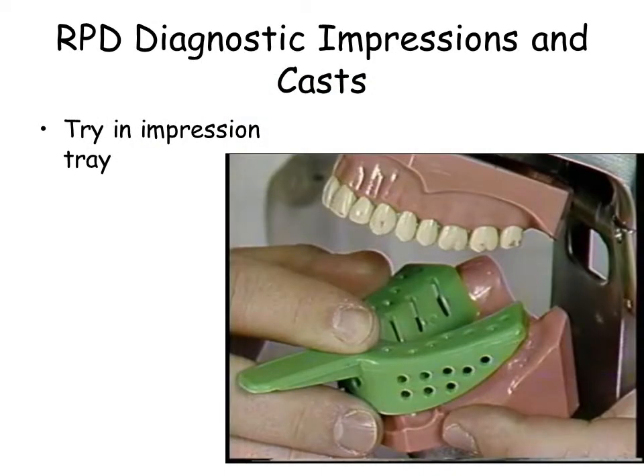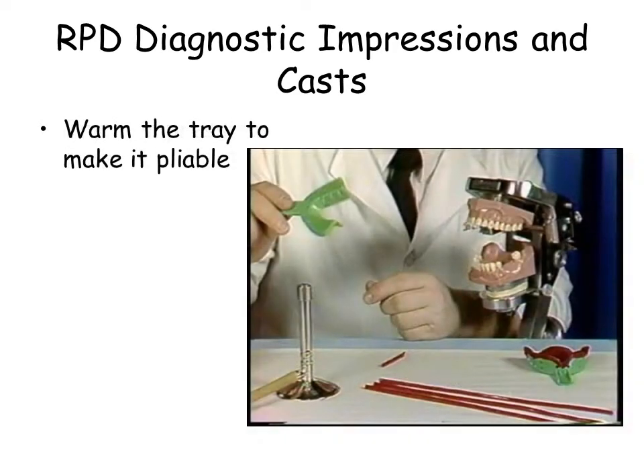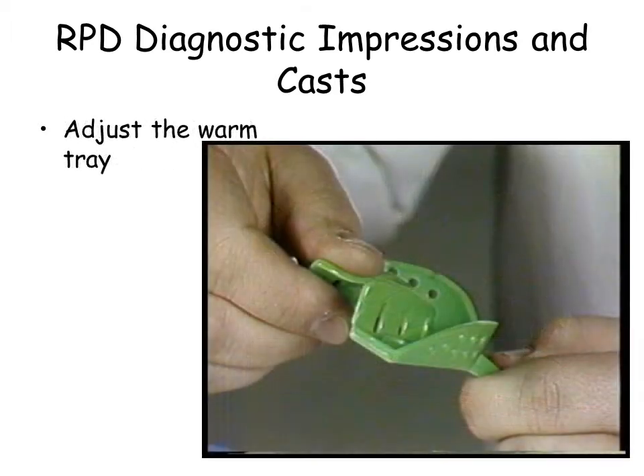Acquire the largest mandibular stock tray and try it on the mannequin. Warm the stock tray using the Bunsen burner to expand the lingual flange of the tray. Use care not to overheat the tray.